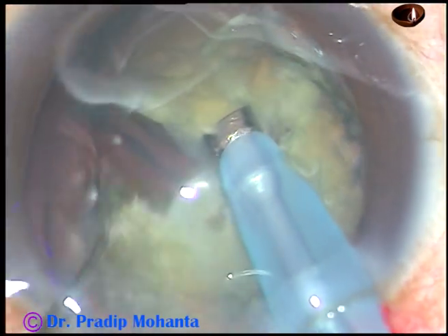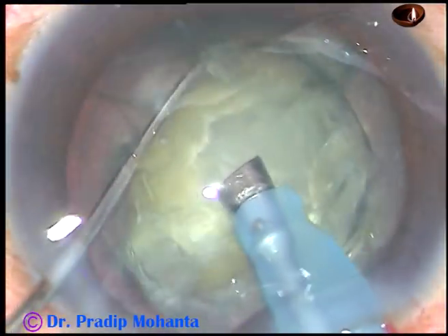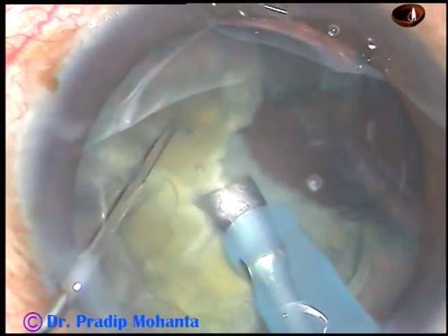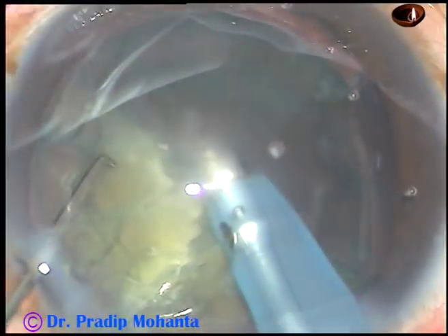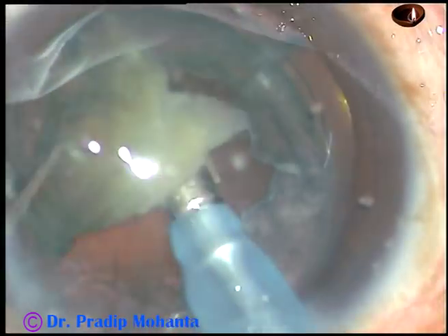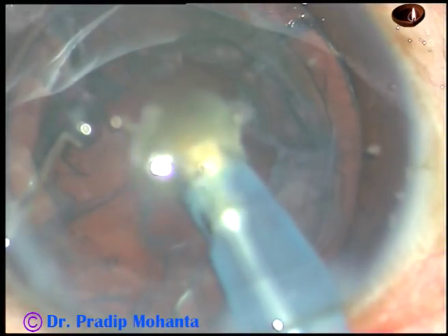Rotated, chopped at another place, rotated again. Making these chops, the nucleus has been divided into four fragments. Now each fragment is held and emulsification is carried out. Sometimes we may have to subdivide the large fragments into smaller pieces and manage the nucleus in this way.